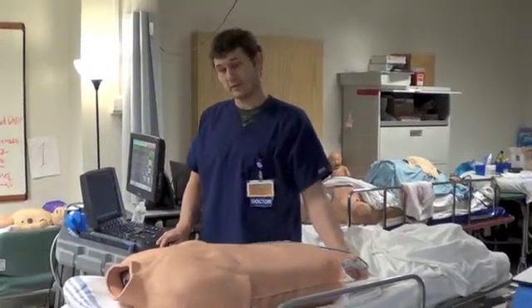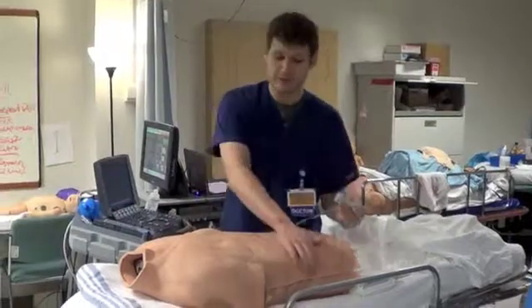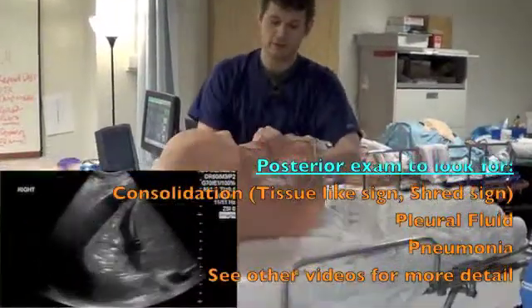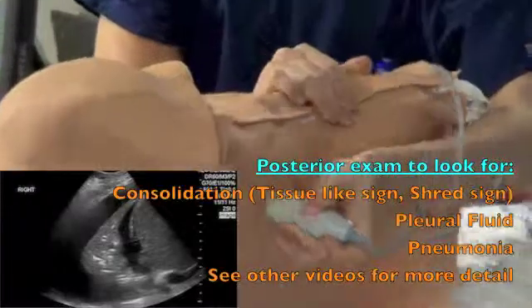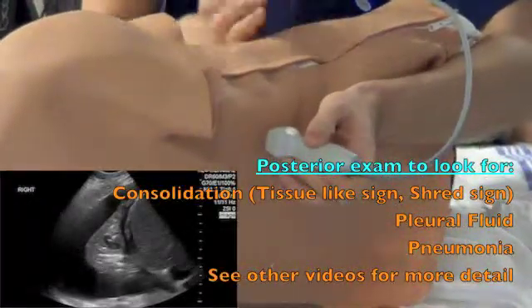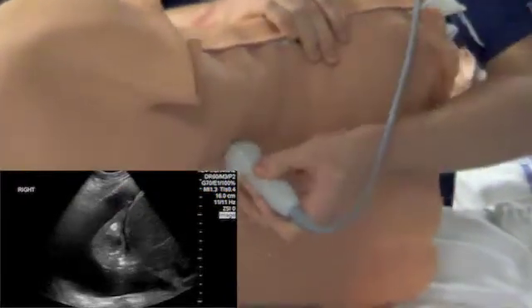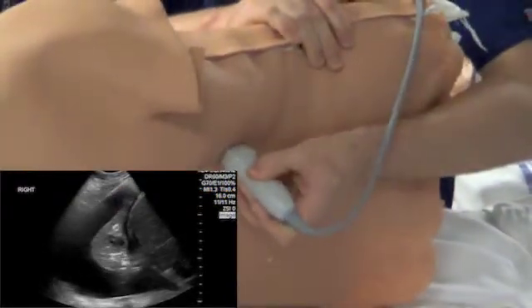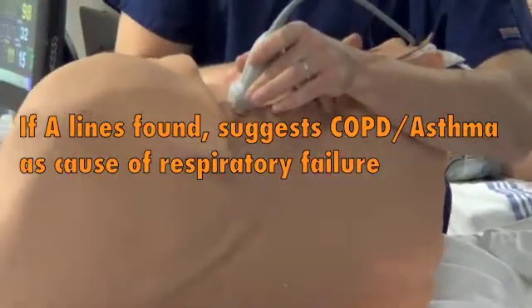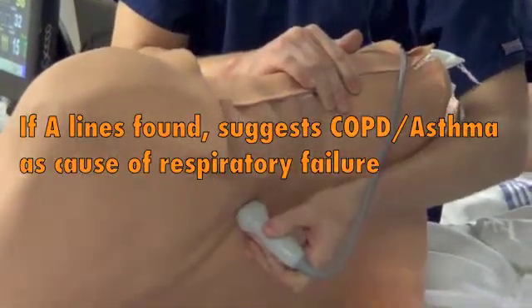If the DVT study is negative, you need to move to the posterior exam to evaluate the posterior BLUE points of the patient. Put the patient in left lateral decubitus position — as portrayed here with our mannequin — and look at the posterior lung field. Be sure not to look at the lateral aspects of the patient, but truly the posterior lung field.